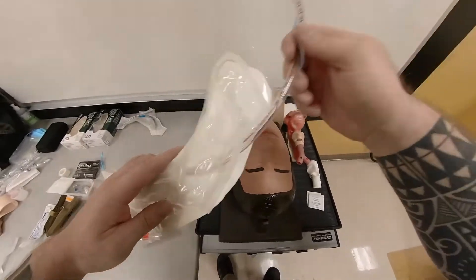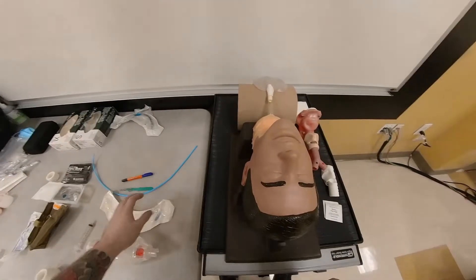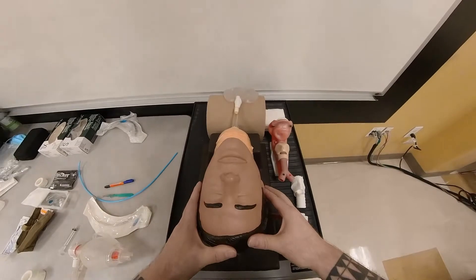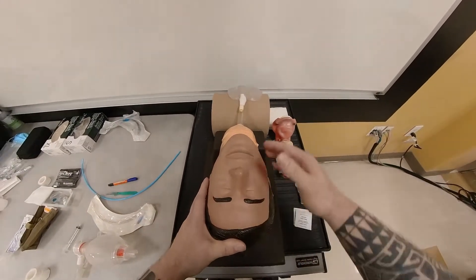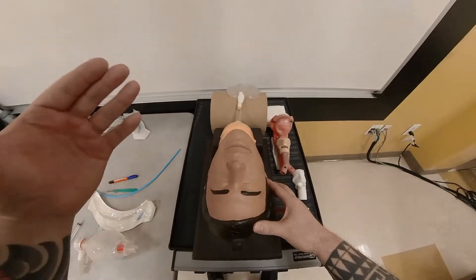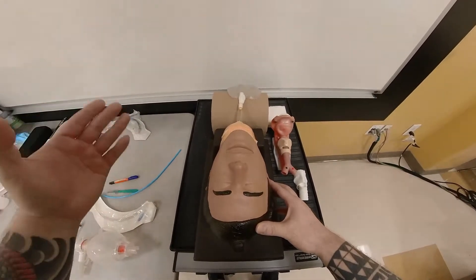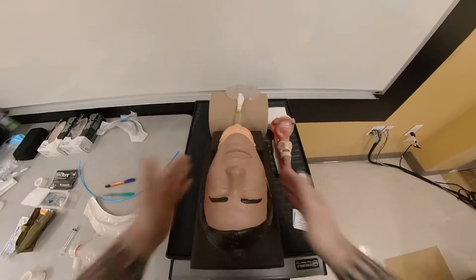Cricothyrotomy — oftentimes when this is advocated, when your patient comes in, you really prepare and mark your location of the cricothyroid membrane so that you know that after the third attempt and supraglottic airway did not work, you go straight to surgical cricothyrotomy.